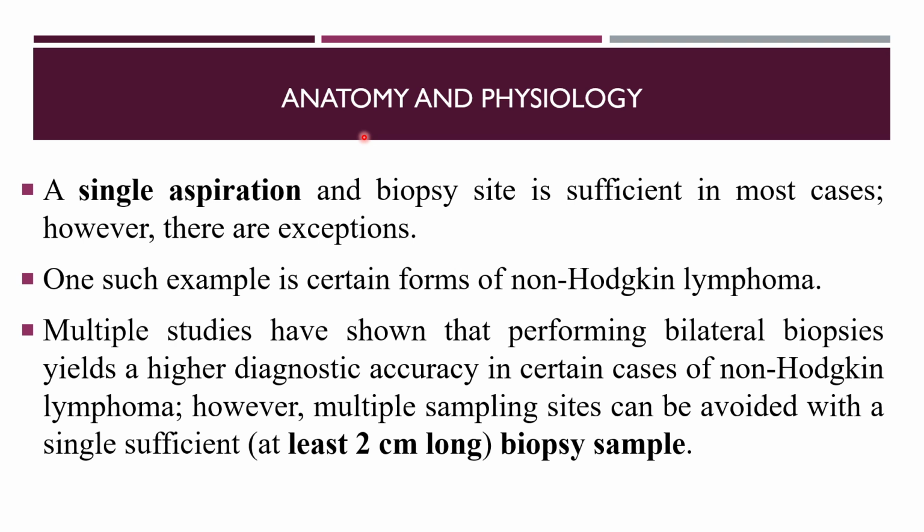Whenever the doctor prescribes bone marrow aspiration, the physician will collect the sample once, and they will assess certain conditions such as non-Hodgkin lymphoma, some cancerous conditions, or some hematological disorders related to hematopoiesis. Multiple studies have shown that performing bilateral biopsies yields a much higher diagnostic accuracy.